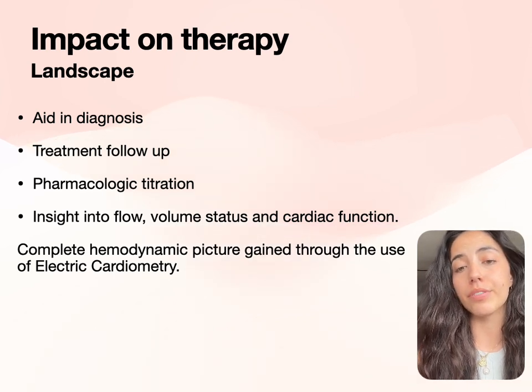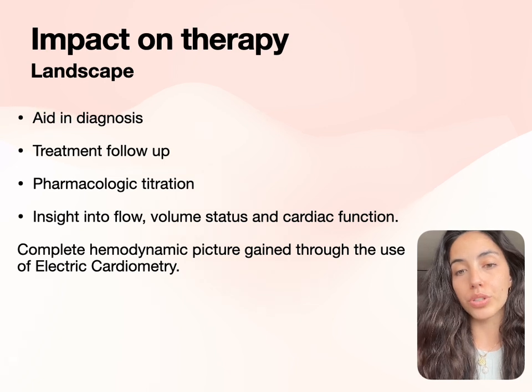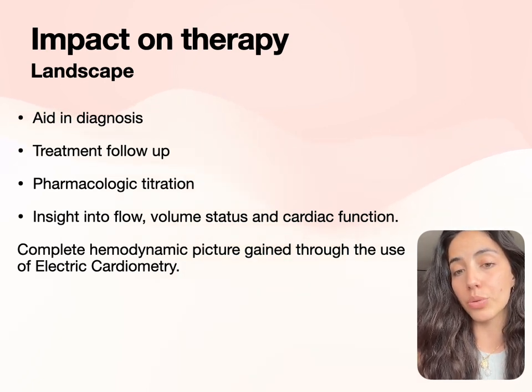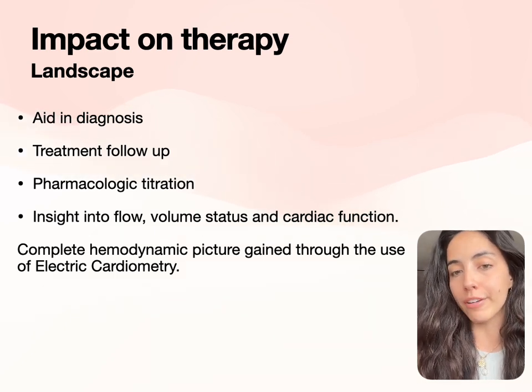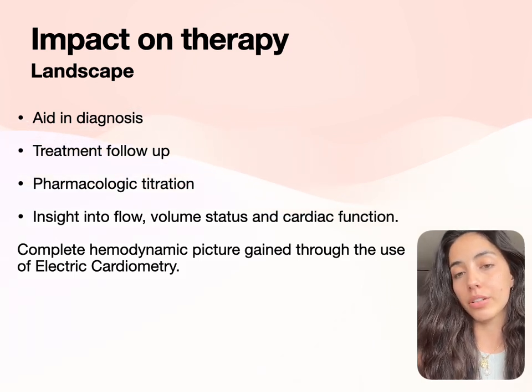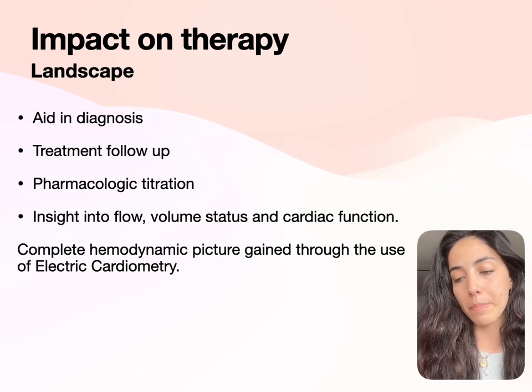And it's going to give us a very close approach into how a patient's flow, volume status, and cardiac function is doing without having the need for invasive parameters. We can use electrocardiometry to, in summary, gain a complete hemodynamic picture of a patient's status.